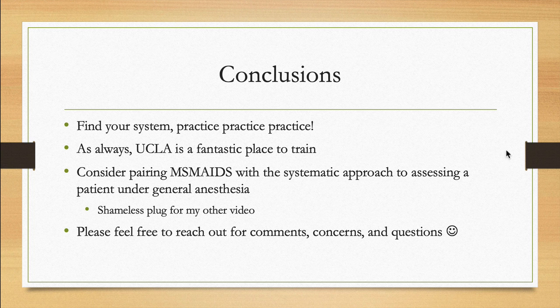Okay, in conclusion, find a system that works for you and practice it until it becomes second nature.